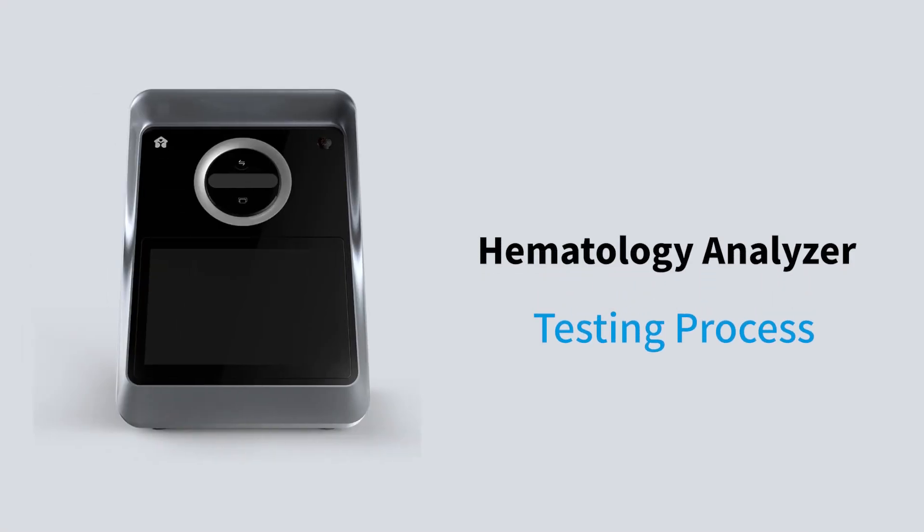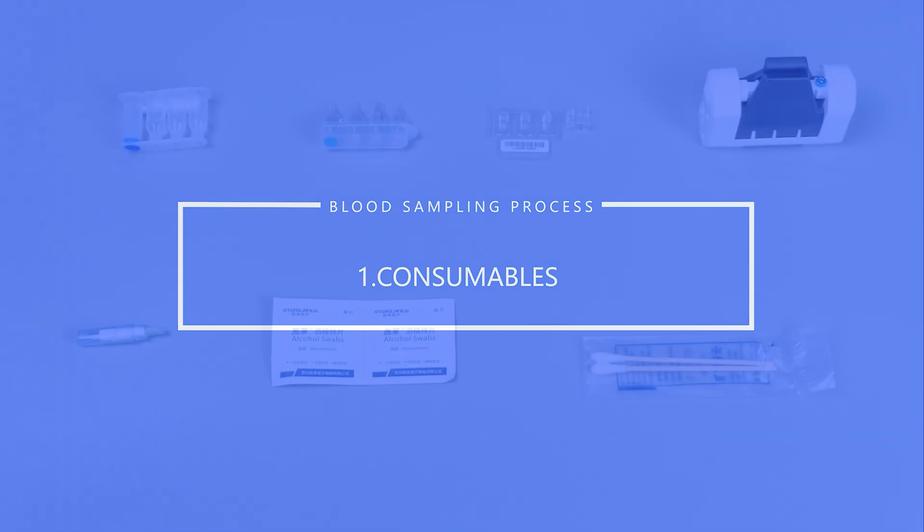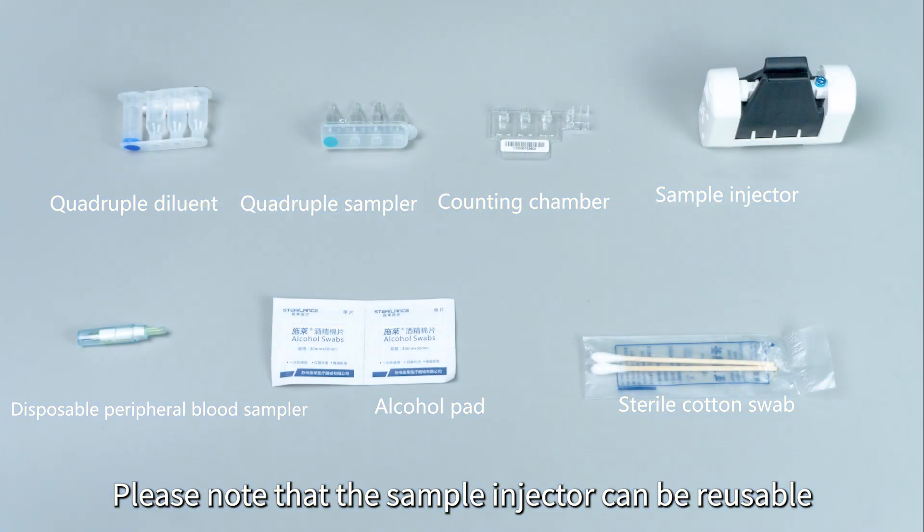Hematology Analyzer Testing Process. Consumables. Please note that the sample injector can be reusable.